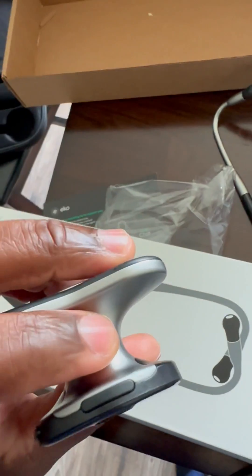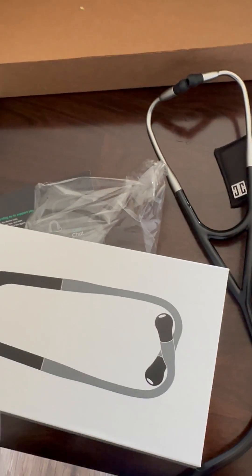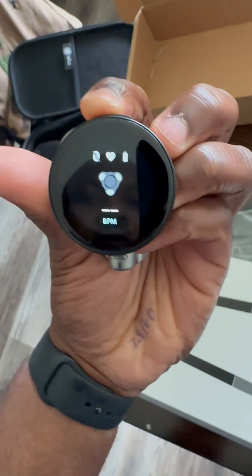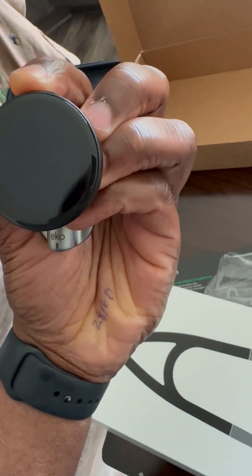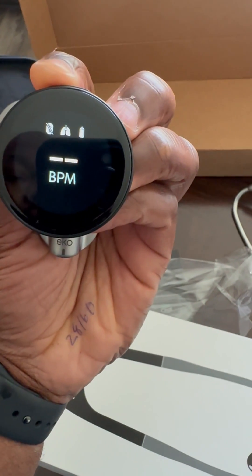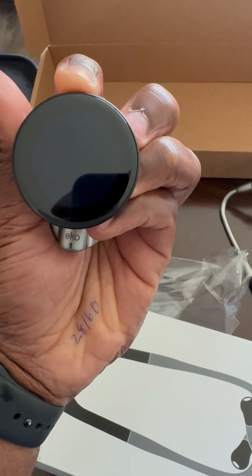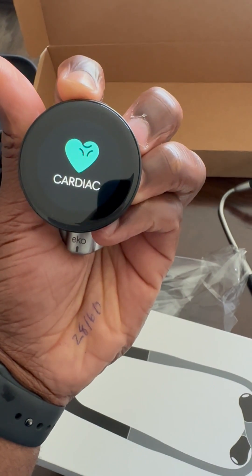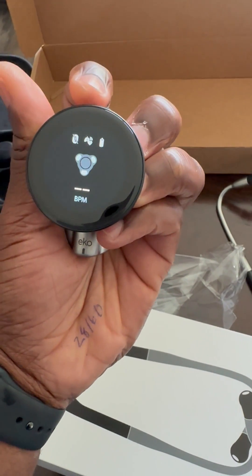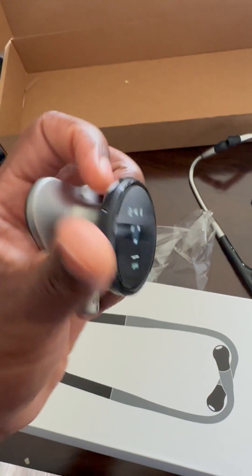You get three buttons — one on top and two on the side. The one on top is basically to turn it on and turn it off. Once it's on, you can select different types of assessments, either the heart, the lungs, a wide range setting for the lungs, or the abdomen.